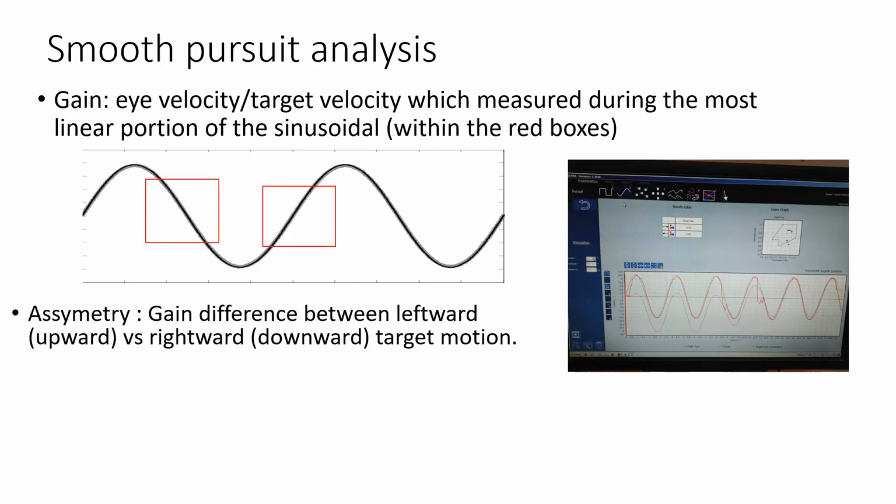Now we go to how we analyze the smooth pursuit tracing. Usually we will perform the test for 2 to 3 attempts. Sometimes we do need to instruct the patient on how to do the test, because we intend to prevent the patient from becoming drowsy or closing their eyes. During the test, mental tasks should be carried out to ensure that they remain awake and alert.